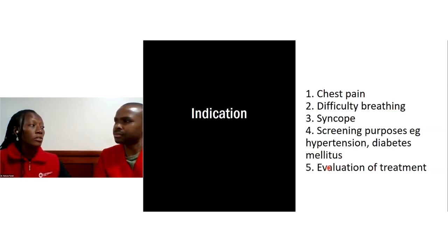We also do it to evaluate treatment. So those patients who come with myocardial infarctions, they've been thrombolized or they've undergone a PCI. So we want to know how successful our treatment has been. Those are some of the indications of doing an ECG on a patient.